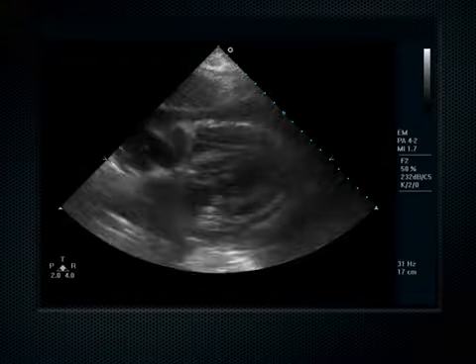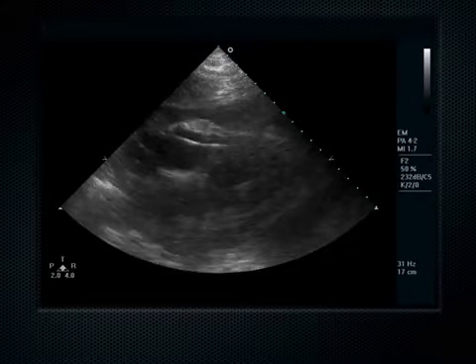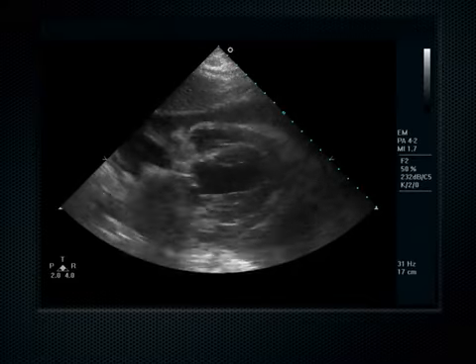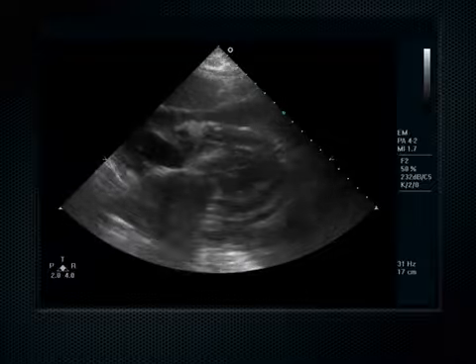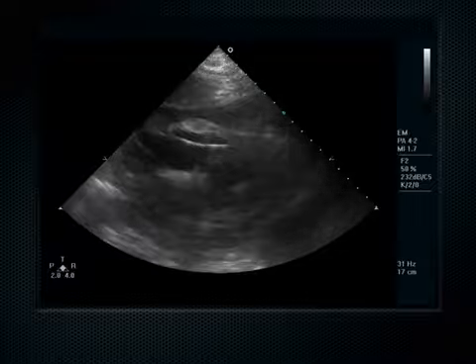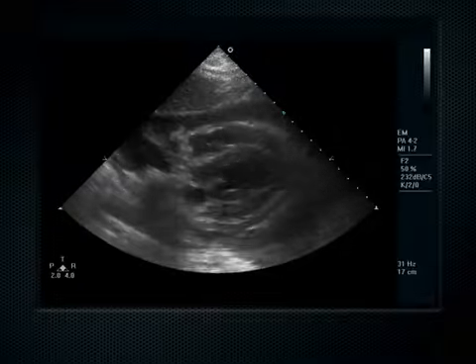Yeah, the problem is when you get a gunshot wound to the chest and you could have both a pericardial effusion and a pleural effusion, then you're really stuck. Because the pericardium can drain into the pleura. Yeah. Or it could have both of them. Tamponade could be your problem, or hemothorax could be your problem, or both. Yep, and then it's thoracotomy. Thoracotomy time, yeah. Okay, guys.